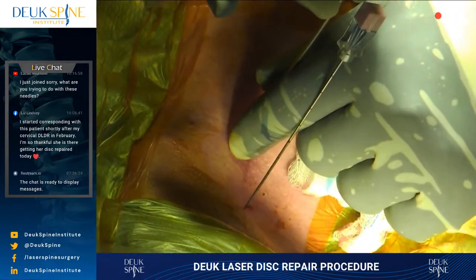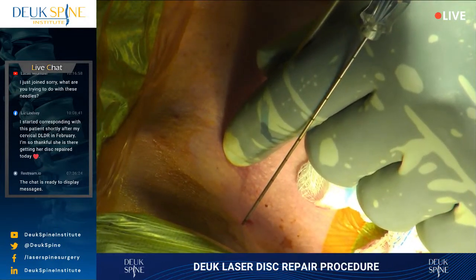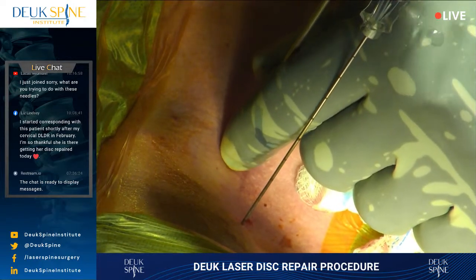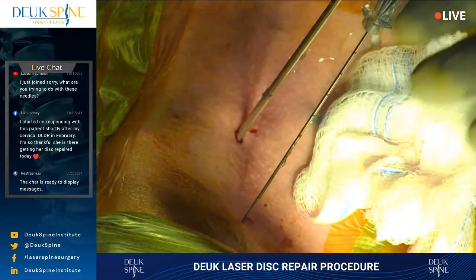Okay? Who's moving his head? Are you moving his head? I'm just testing his switches. Yeah, I don't want you to do anything while I'm doing this, okay?